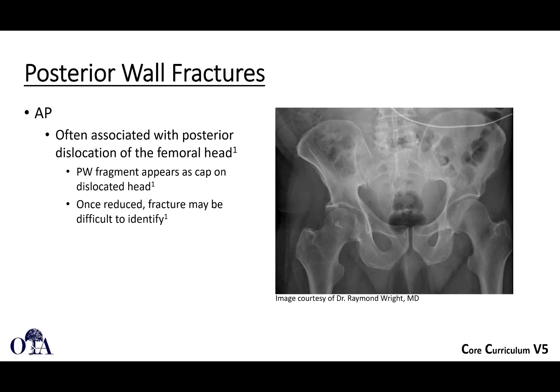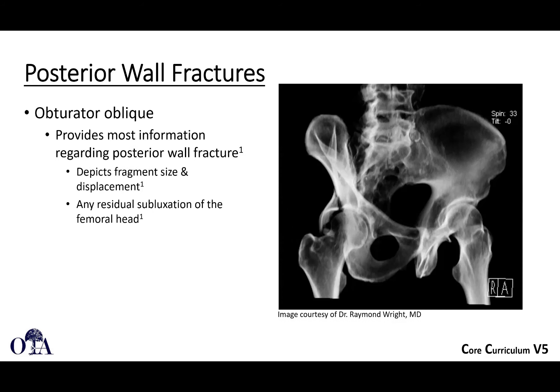You can see there's some abnormality when you compare the contralateral side, and fragmentation of the posterior wall. On the obturator oblique view, you will see a lot because the head is out of the way and the posterior wall is very nicely seen. It's typically displaced posteriorly and a little bit superiorly, and you can get a good sense of what's going on here. If the femoral head is subluxed, you're going to see that too.